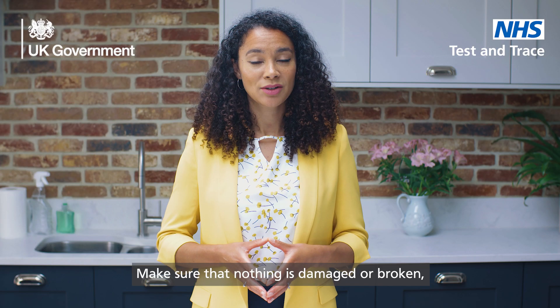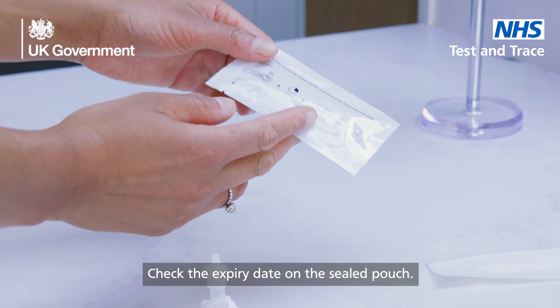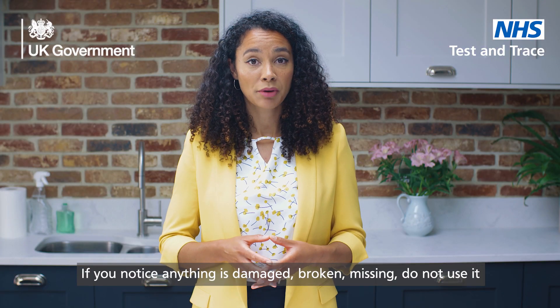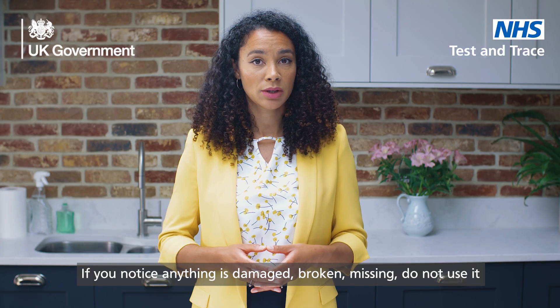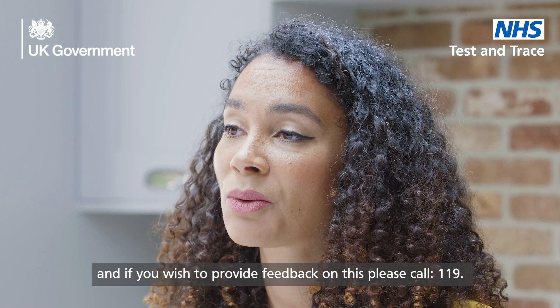Make sure that nothing is damaged or broken before undertaking the test. Check the expiry date on the sealed pouch. If you notice anything is damaged, broken, or missing, do not use it. If you wish to provide feedback on this, please call 119.